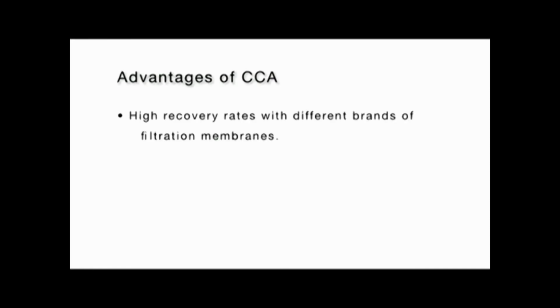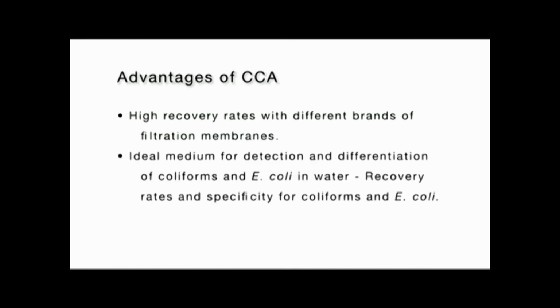Advantages of CCA. High recovery rates with different brands of filtration membranes, especially when using our coliform CV selective supplement. Our CCA agar is the ideal medium for detection and differentiation of coliforms and E. coli in water.